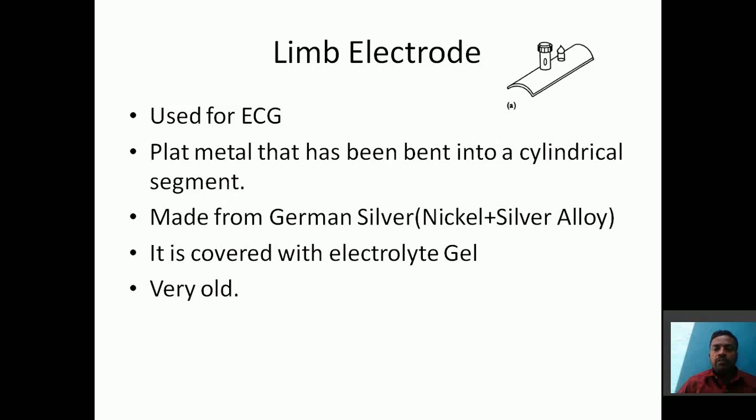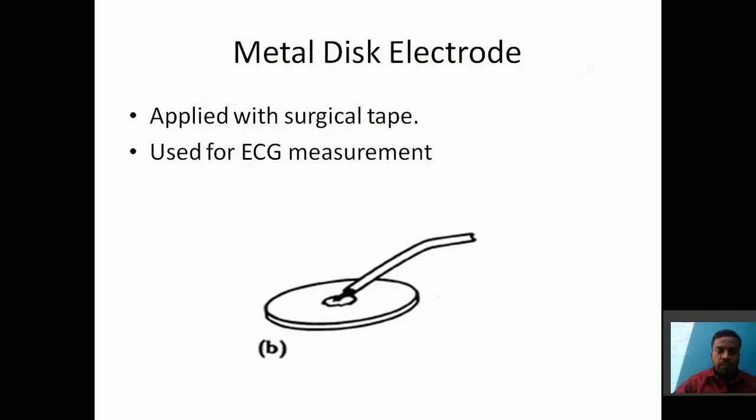Nowadays we are not using this type of electrode. It is somewhat hard and it has heavy weight. Okay, to hold this electrode we need surgical tape or other things, to hold the electrode on our body. Okay, right. Next one is the metal disc electrode.